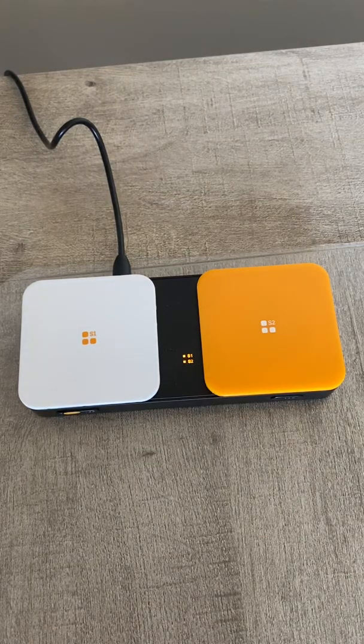Hi, this is Angela Murad at Amazing Kids AAC Consulting. This video is going to show how to use the Bluetooth switch by AbleNet with GoTalk Now.